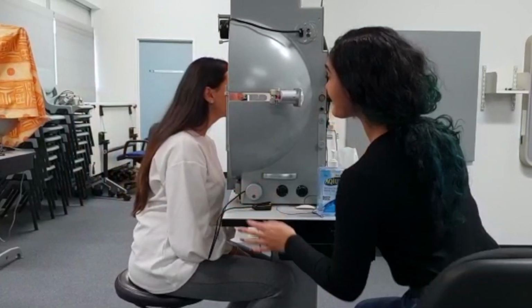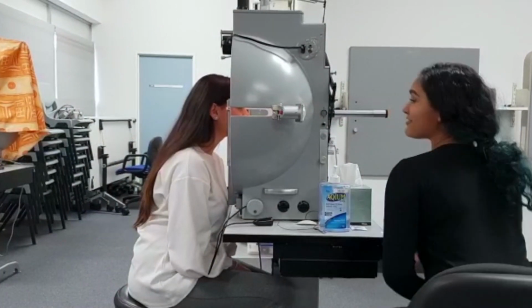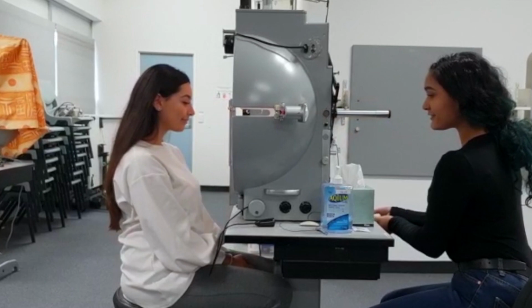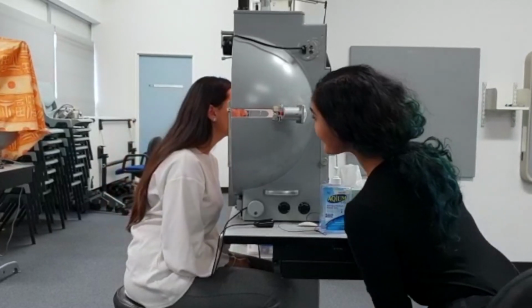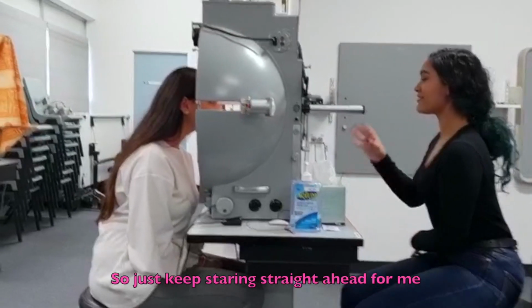So just put your chin down again. Is that high enough for you? Yeah, just a bit lower. A bit lower? Okay, just sit back again for me. Try again. Is that one fine? Yeah. Yep. So I'll just see your eyes centered, so just keep staring straight ahead for me.